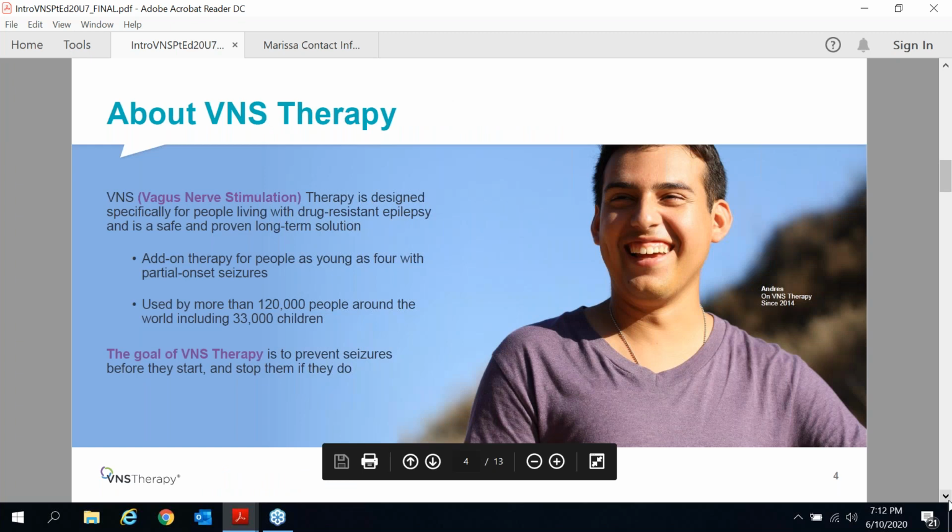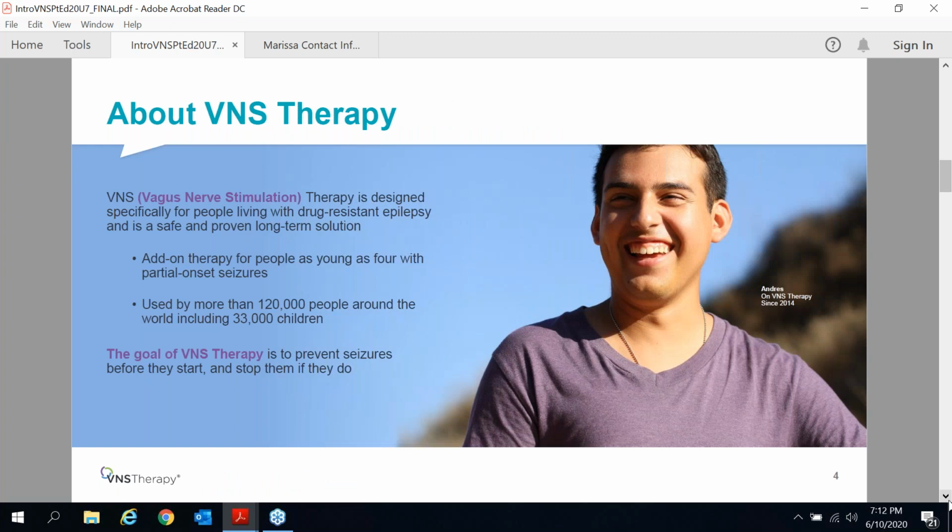So what is VNS therapy? VNS therapy stands for vagus nerve stimulation. So the vagus nerve is a nerve in our neck. And VNS therapy is a small implanted device that's designed specifically for people with drug-resistant epilepsy. And I'm going to show you in just a minute what it looks like. And I have a little demo here too I can show you.